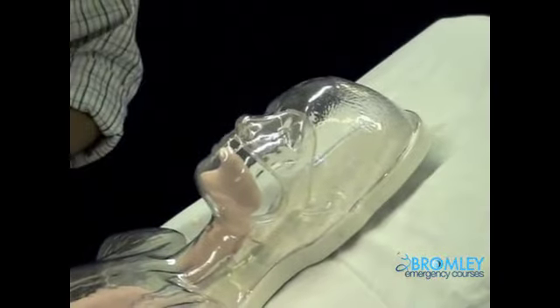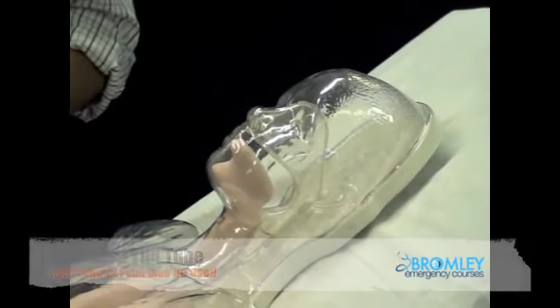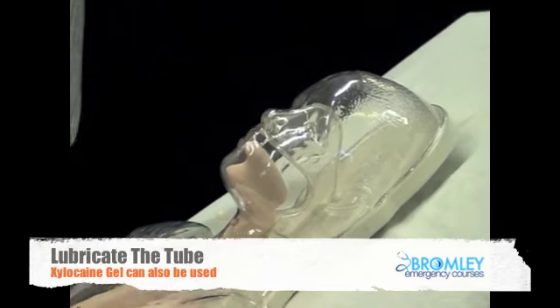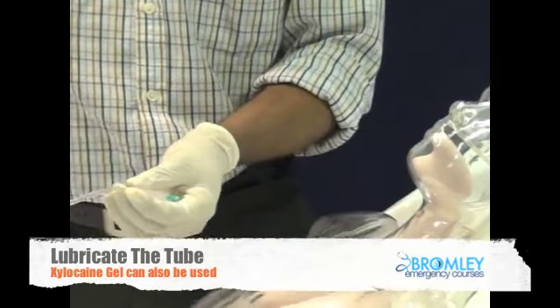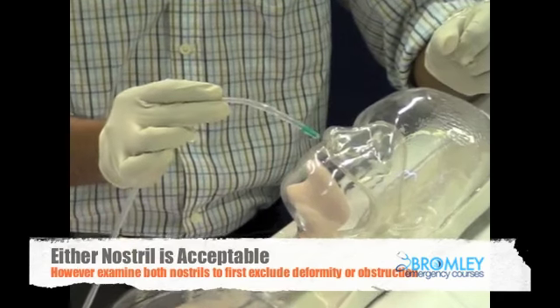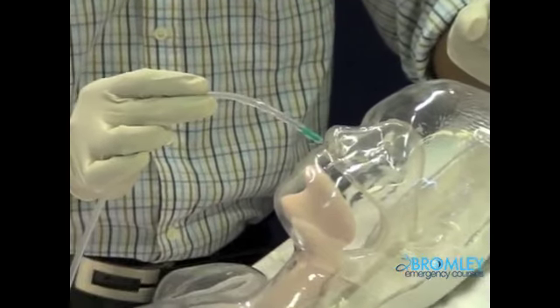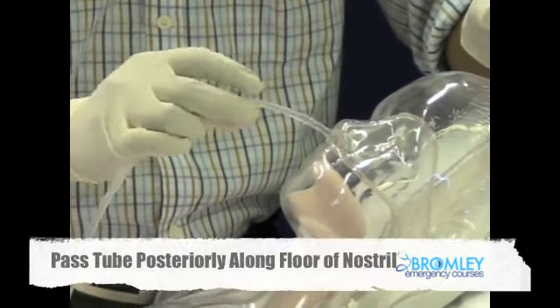After we made the measurement, lubricate the 5 to 6 centimeters, the distal end of the NG tube, with Equigel. You can choose either nostril. Run along the floor of the nostril, parallel, posteriorly.